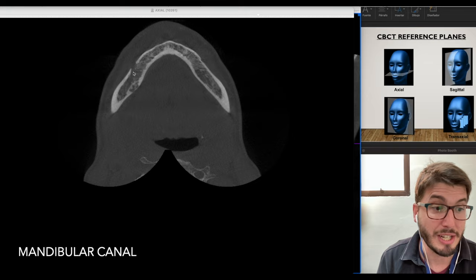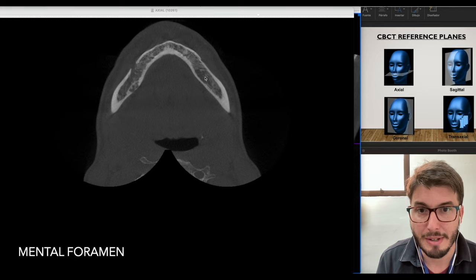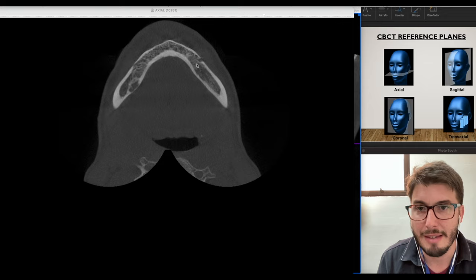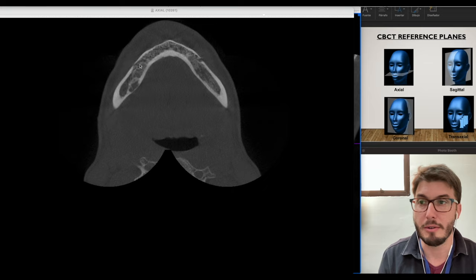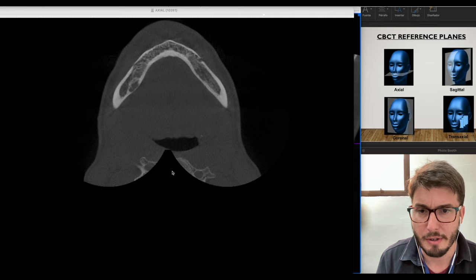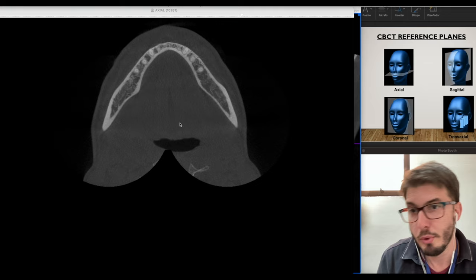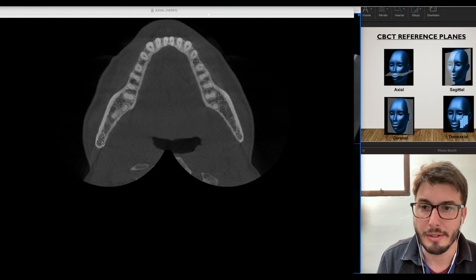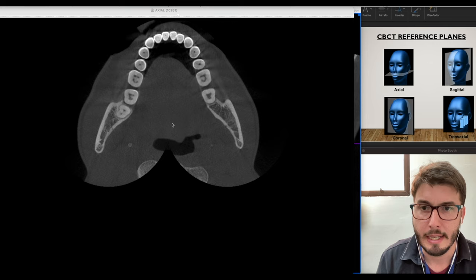Eventually we're going to see the mandibular canal and the mental foramen on both sides, even though we can see them in different slices — left and right mental foramen sometimes appear in different slices. I have here some cervical structures: the vertebra. Then the roots on the left, the shape of the posterior mandible, and the ramus starting to appear. Here are the roots of the third molar.